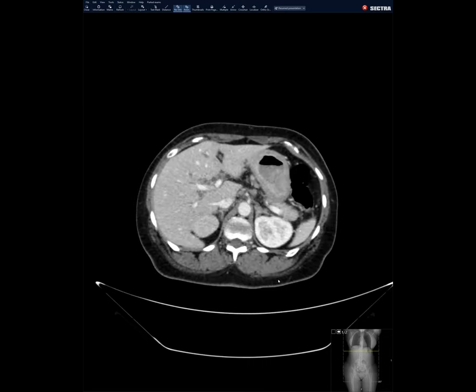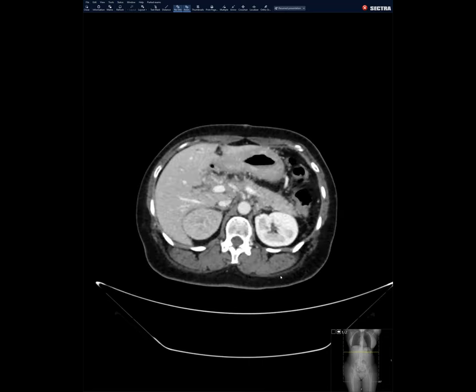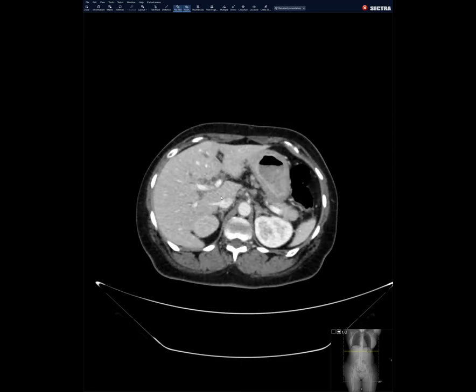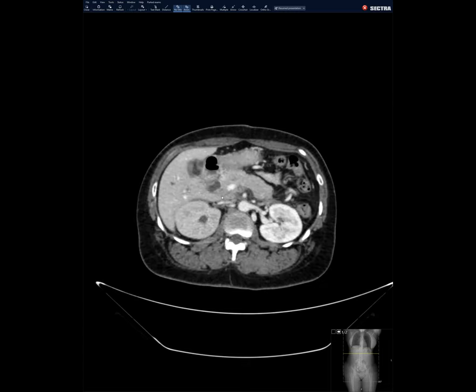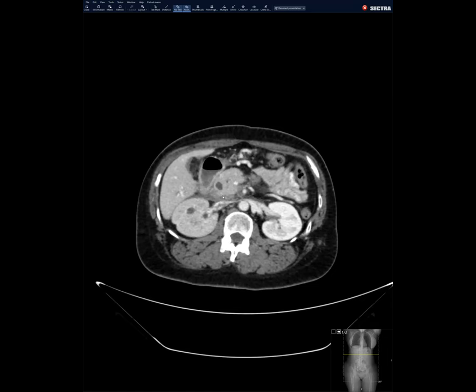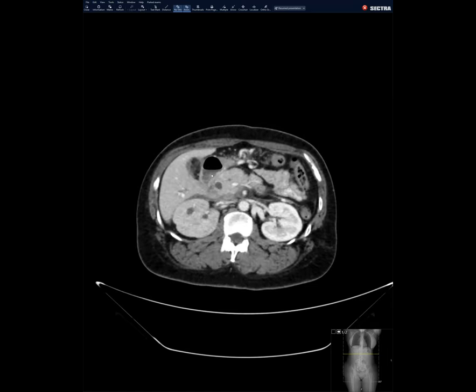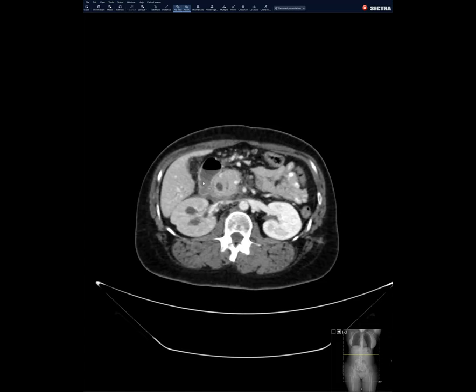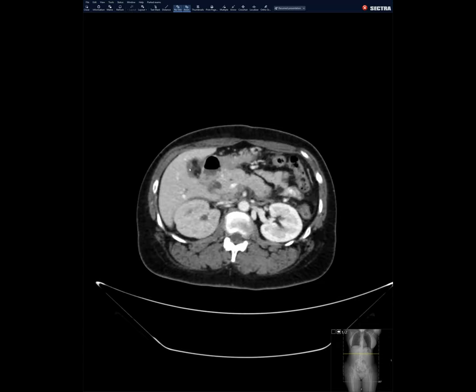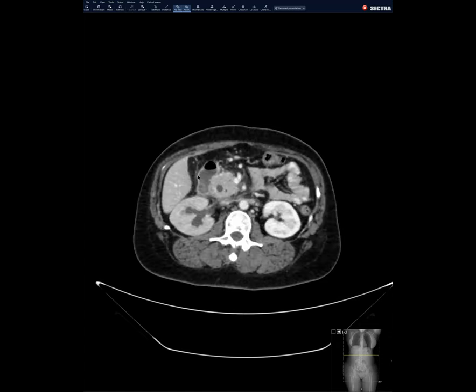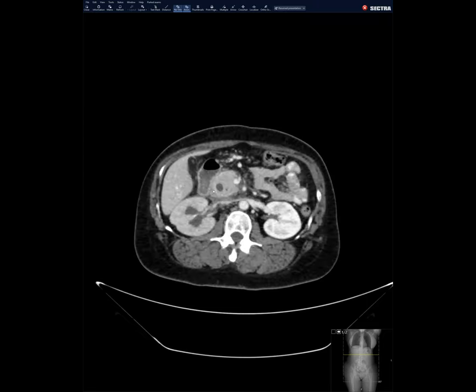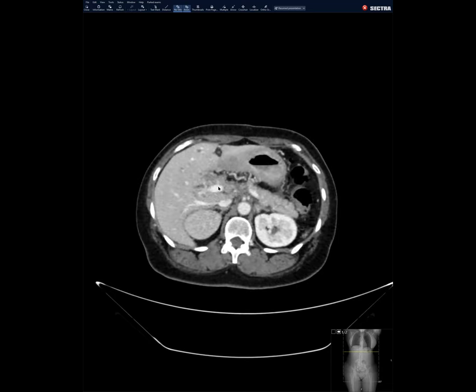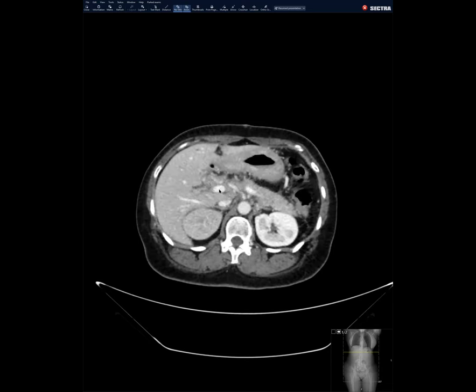I'm seeing a hilar mass causing biliary obstruction, and then the bile duct comes back. All the fat planes in the hilum were lost — it's interfacing with both the right and left portal vein. I also saw some masses in the pelvis, which I'm presuming are related metastases. That's the gallbladder fossa — there's a soft tissue rind over there. And as noted, an obstructing hilar mass with upstream biliary dilatation.